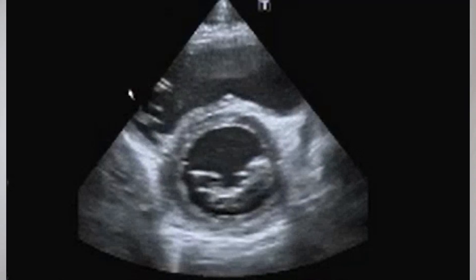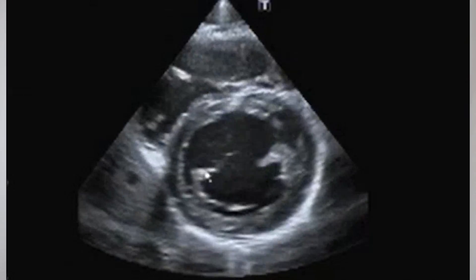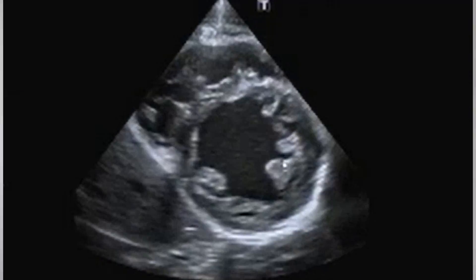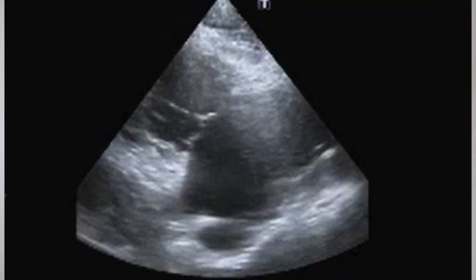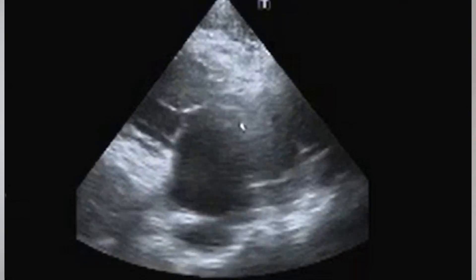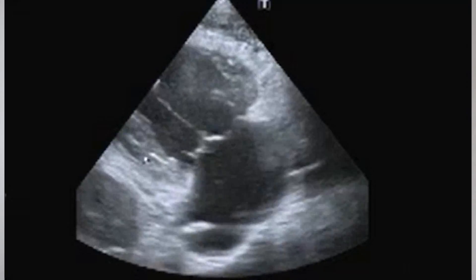I then tilt my probe to concentrate on the mitral valve. In this view I see the right ventricle, the left ventricle which looks like a circle in this short axis view, and the mitral leaflets with the anterior leaflet and the posterior leaflet displayed in the middle of the circle. I then angle my transducer slightly to the left ventricle at the level of the papillary muscles, with the left ventricle still looking circular. To assess the right side of the heart, I tilt my echo transducer to the right side where I can see the posterior leaflet of the tricuspid valve, the anterior leaflet, the anterior wall and inferior wall of the right ventricle, and the right atrium.